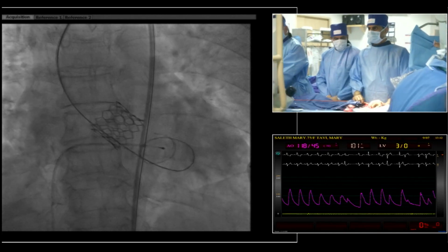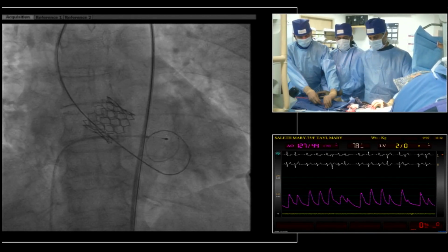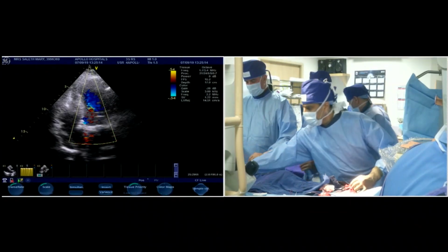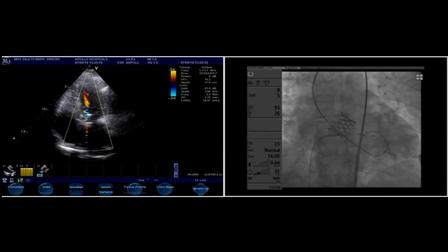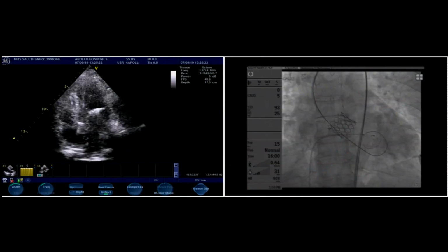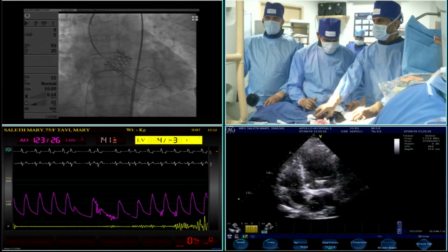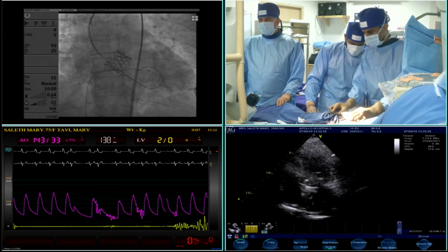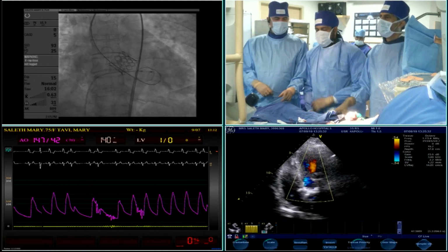Okay, so now you have the patient with some spontaneous adrenaline injection, so that's why the pressure now is very high. It's auto injection. Now the team is checking echo. So we're going to give you an aortogram, and then we've got some echocardiogram images appearing at the same time. So let's do an aortogram when you're ready.